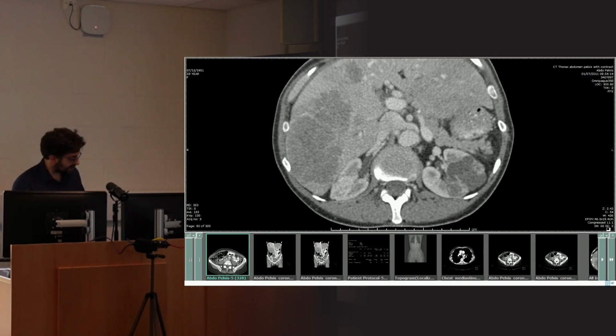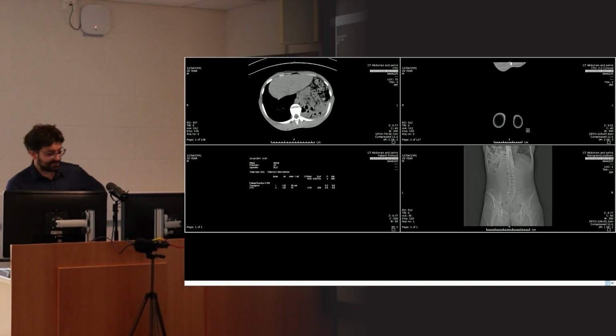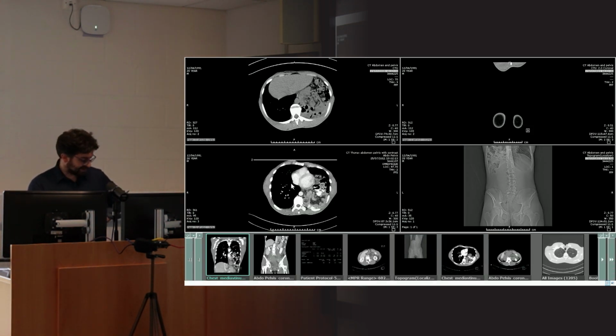So for my final case, I'll show you, this is probably my favorite case that I've ever seen, although over the years it has been challenged by various other cases. But this is a great case.